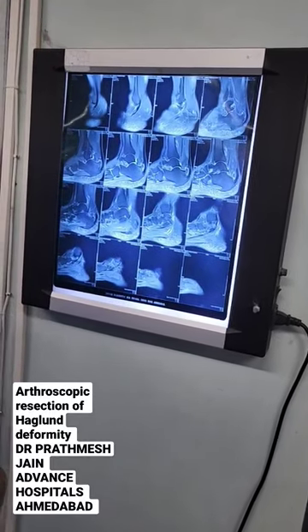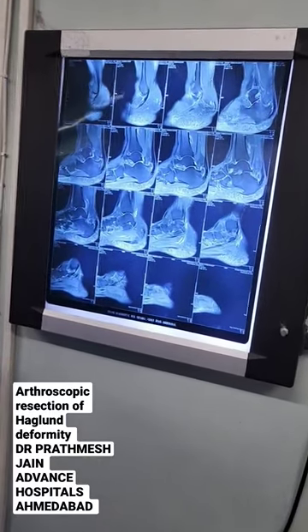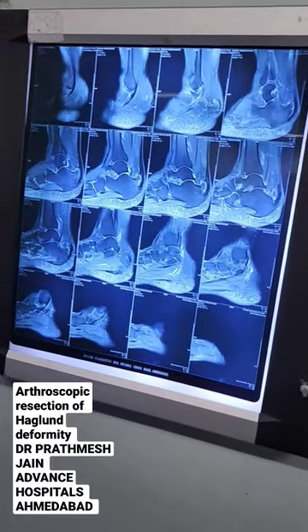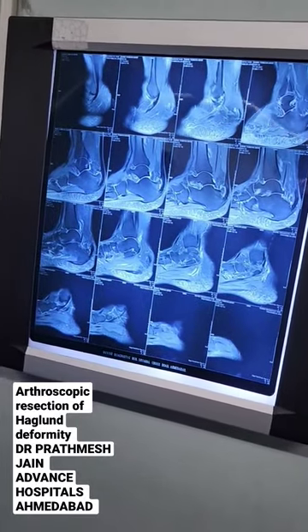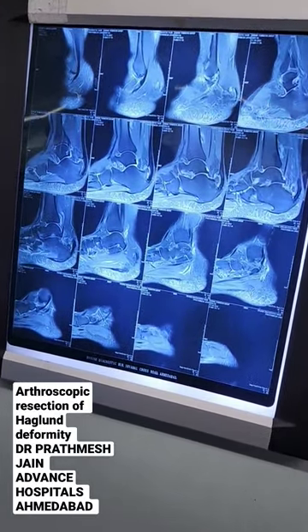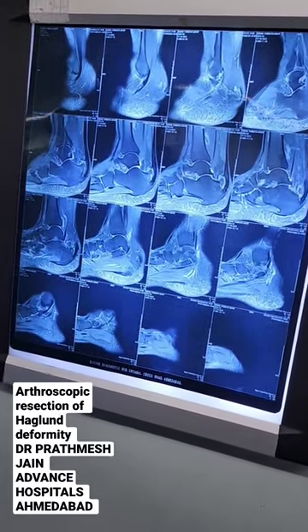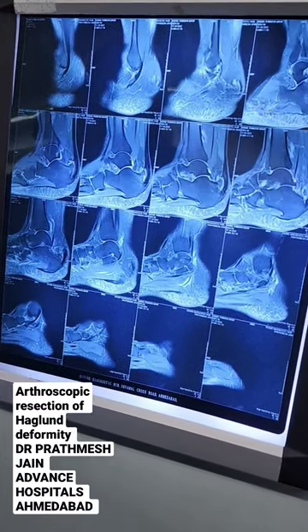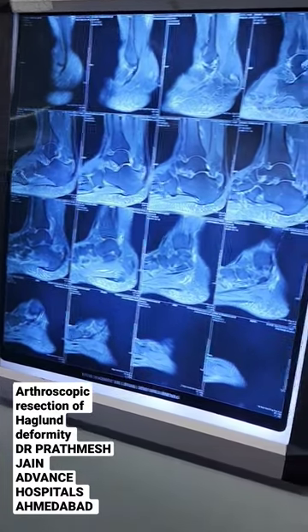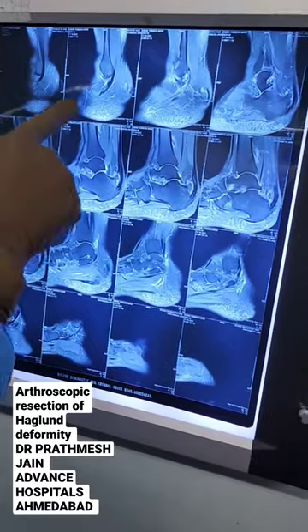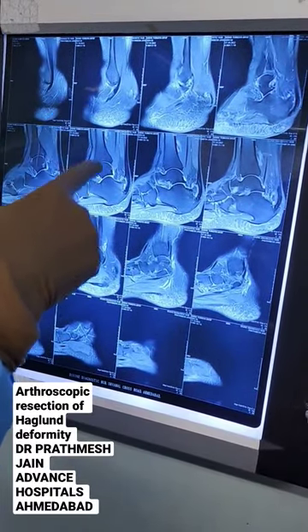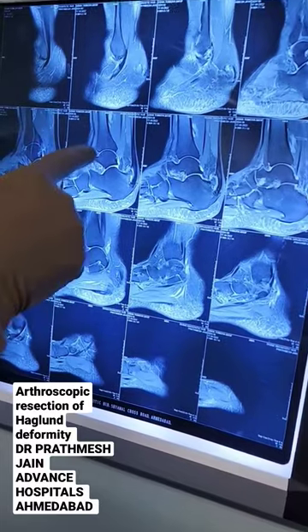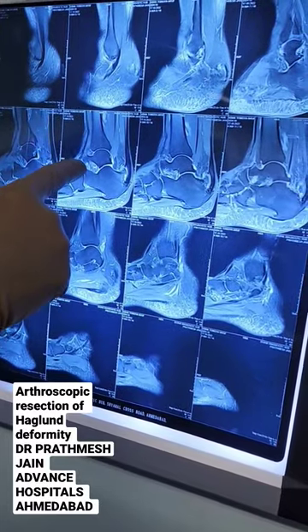She is a 64-year-old lady who has presented with severe pain in the back of her ankle. You can see there is a very large spur on the posterior side of the calcaneum, which is called a Haglund deformity. The tendon is intact, but at the inferior part of the tendon there is a large spur.